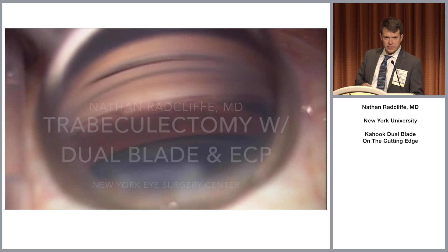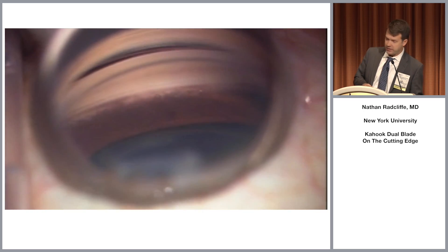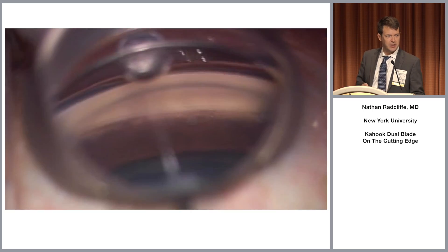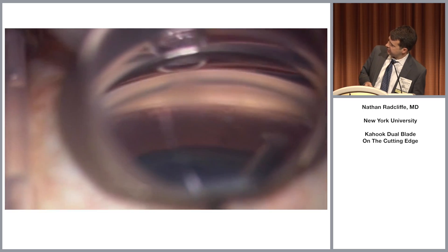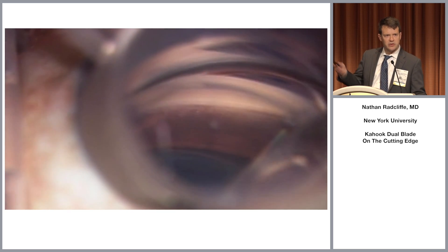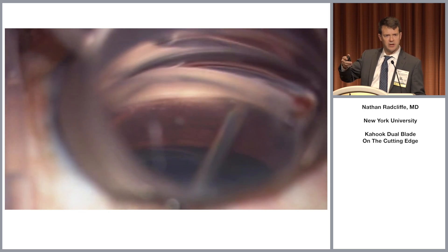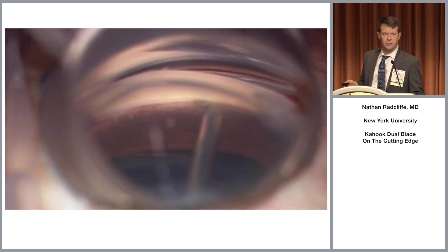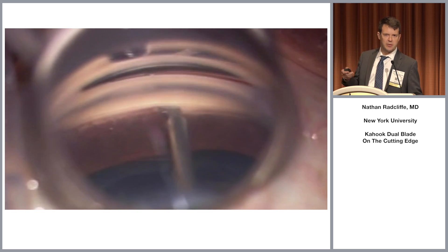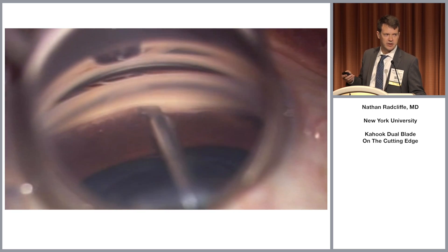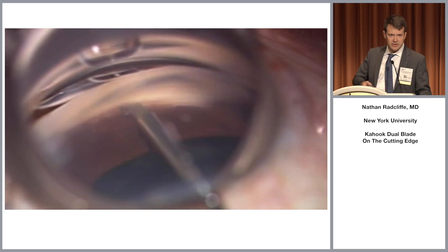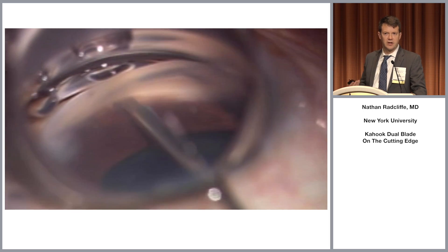We're viewing trabecular meshwork with a deep anterior chamber. It's nice to have good pigment on the trabecular meshwork so you can see your target. We're going to introduce the blade, start on one side of the angle, sweep across, and then come from the other direction. We don't just want to open up the canal — we want to excise the strip of trabecular meshwork. You can really see that the pigmented trabecular meshwork is gone.